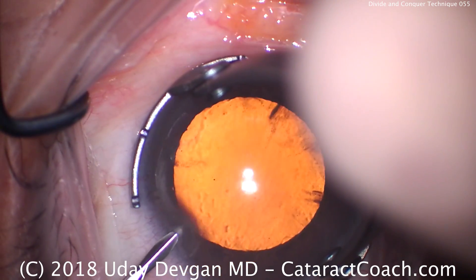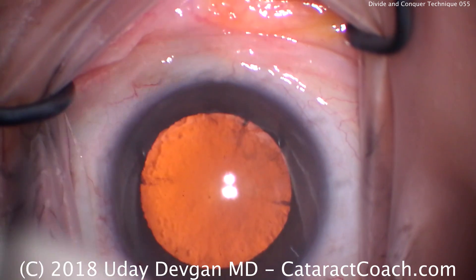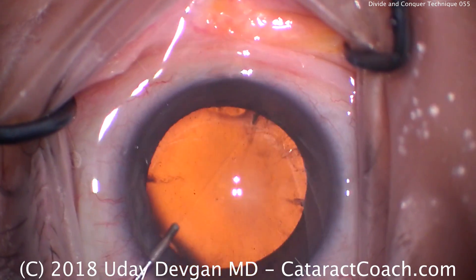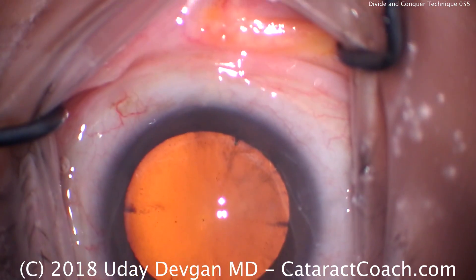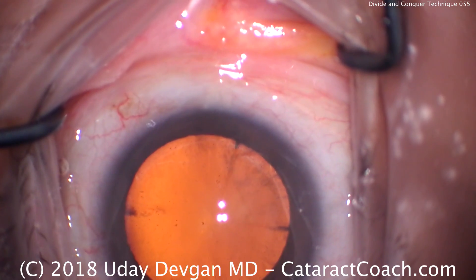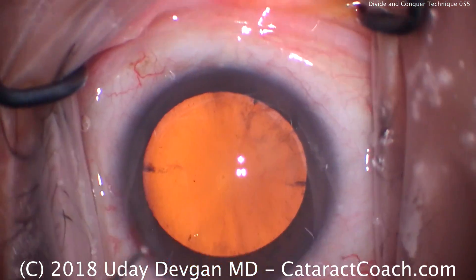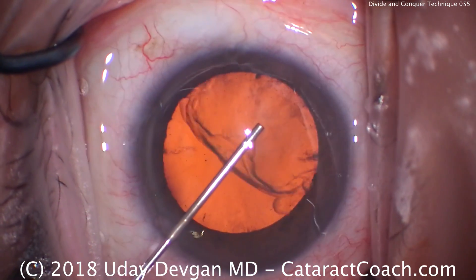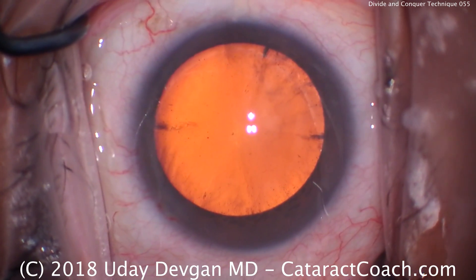Welcome to cataractcoach.com. Today we're doing a divide and conquer technique. My residents often ask me to post a video of divide and conquer, but since it's a technique I don't normally do, I didn't have one available. So today I thought let's record a video of divide and conquer — otherwise a routine case. Residents like to start with divide and conquer and then advance to other techniques later, so let's do an entire case complete with divide and conquer.